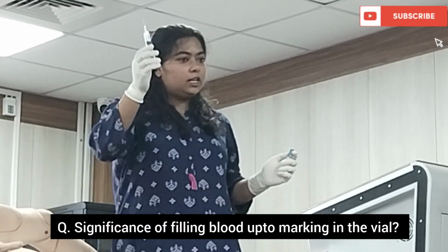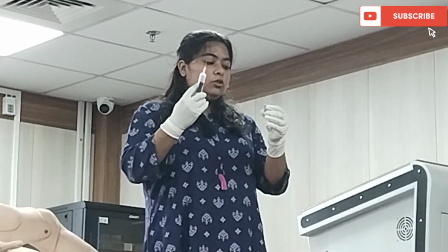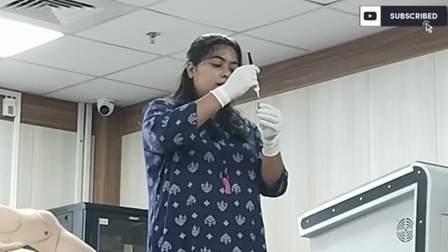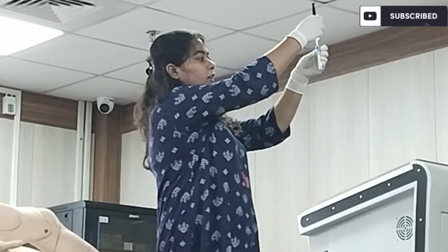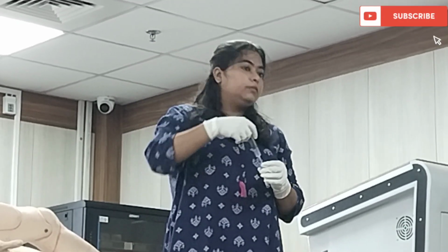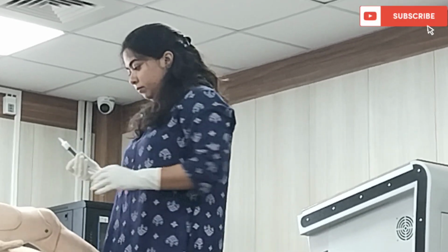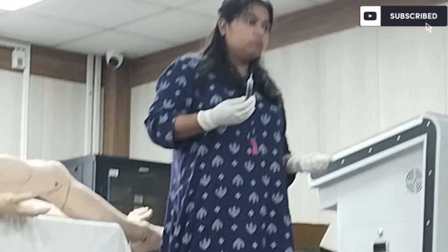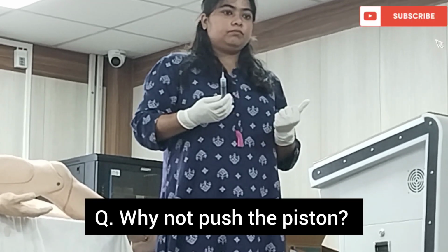So I have explained to you that this is where your blood is drawn. You will put your syringe inside and the blood will go. In some cases you have to push the piston, but here you don't have to. With negative pressure, the blood will automatically flow in. Okay? If you forcibly inject, there occurs hemolysis. So you might be getting an erroneous result.